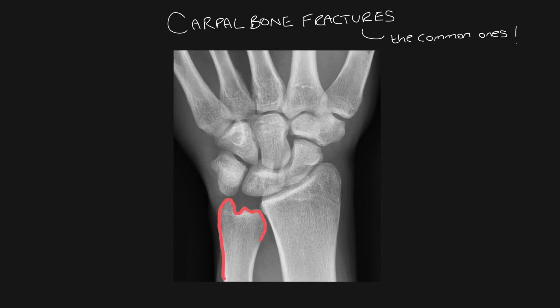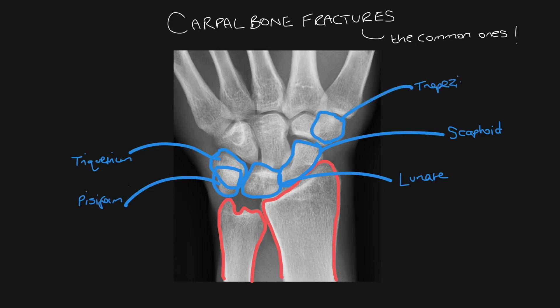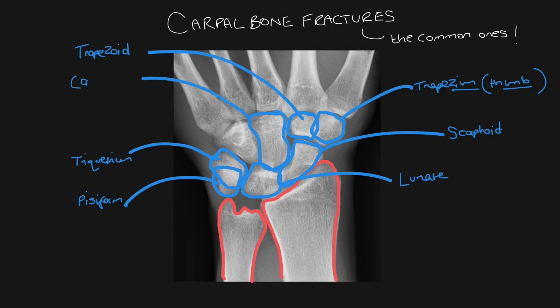In this video we're going to be covering common carpal bone injuries that can be seen on plain film. When assessing the wrist we take a PA, an oblique and a lateral film. The first thing to do is to trace around the bones to look for any breaks in the cortices, starting with the distal radius and ulna, then tracing around all eight of the carpal bones, and then trace around the proximal metacarpals again looking for any breaks in the cortices.